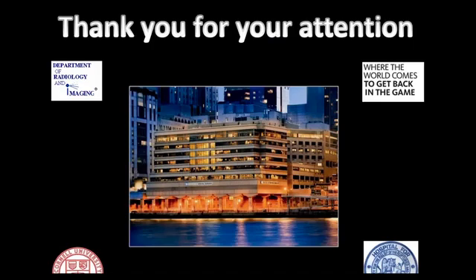Next is, do you find any relevance for weight bearing or standing MRI, plus or minus flexion extension positions, utilizing Fonar scanners? Yeah, I looked at this, and there is an AHRQ technology assessment that came out a number of years ago. It's a bit old, but I've worked at places where they have load-bearing MRI.